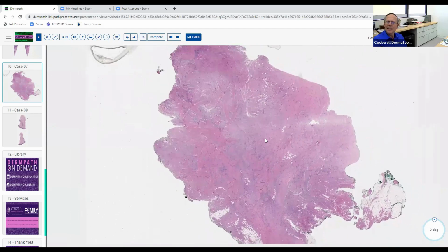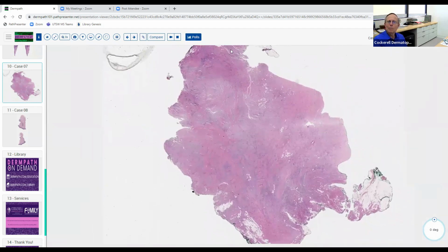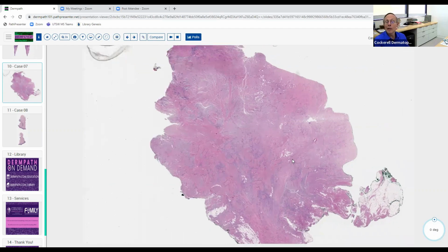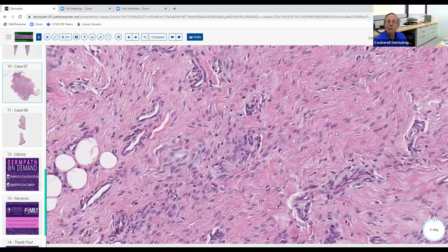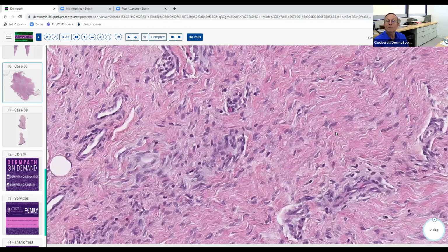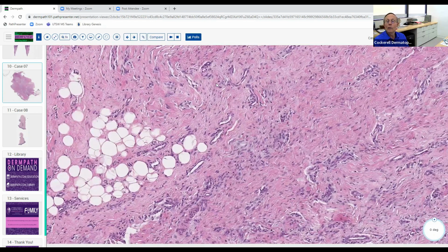Good. And this one's going to be a little challenging from pattern, right? Because they just took a big chunk out of something that was obviously probably in the dermis and tried to shell it out and it didn't shell out. So this could be part of something a lot bigger. So suddenly our ability to assess breadth, symmetry, circumscription is out the door. So we have to use the other features, like you said. We have to go to higher magnification and ask, is there any atypia of these spindle-shaped cells? Are there any mitotic figures? The answer is no. So I agree with you.